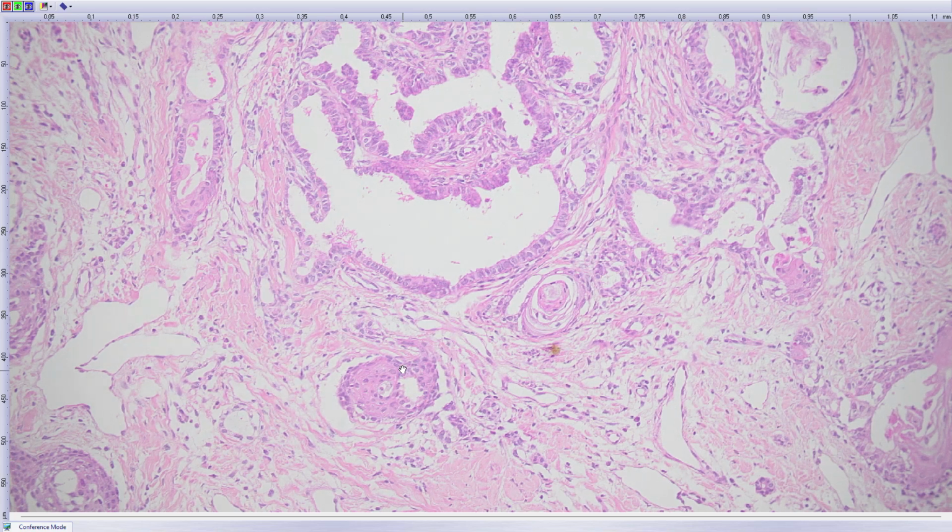First thing is these cystic-like structures, and second is that spindle cell proliferation, which you can see here. But in these two cases, it's very incipient, not seen. And usually, this stroma is retinoblastoma protein deficient, and these epithelial structures are positive.